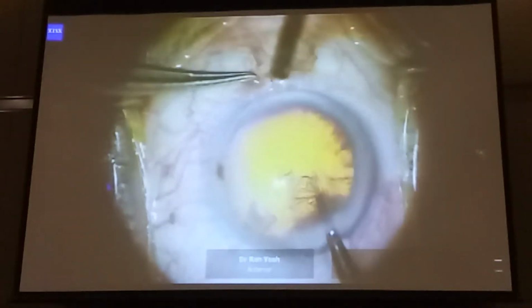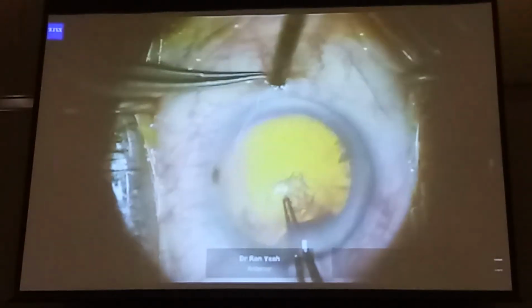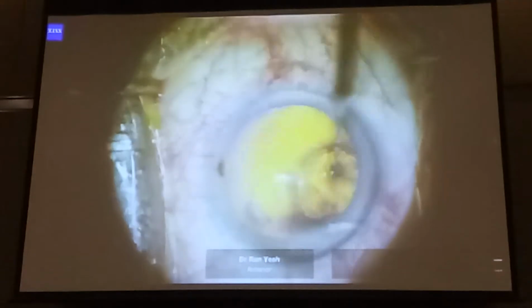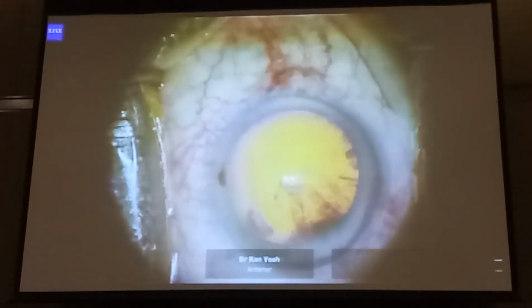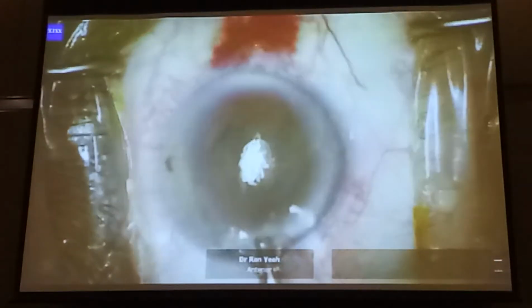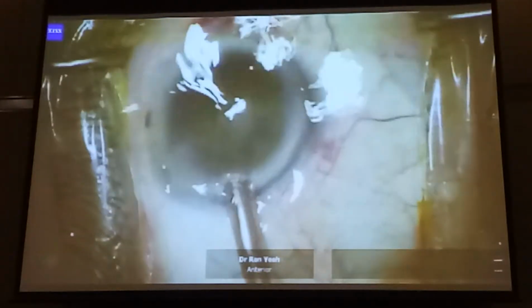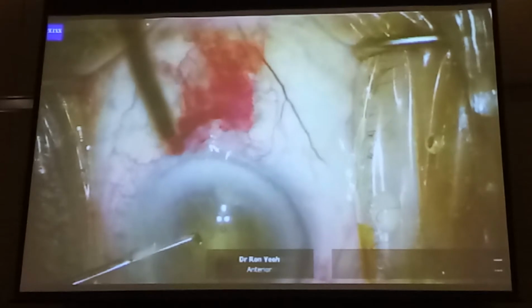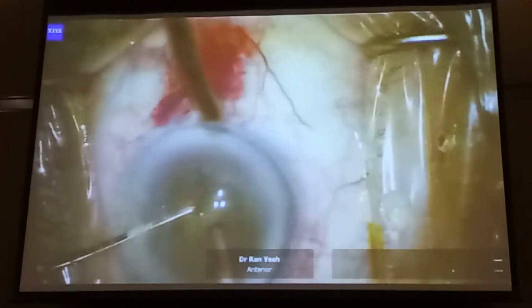Okay, let's move on. What about this? The pre-chopper can also help us get out of trouble. This is one of my colleagues and this is just a 1+ nucleus, and I said, pre-chop this. She said, no, I don't really feel confident doing a pre-chop. I want to do my normal stop and chop technique. So here she is trying to do a stop and chop.